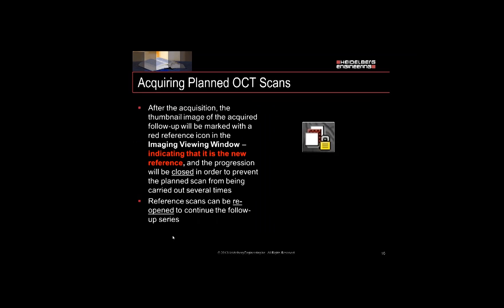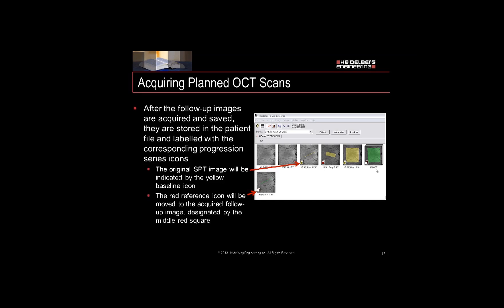After acquisition is completed, the follow-up will be marked with a red reference icon indicating that it is the new reference. This progression will be closed, indicated by the small lock icon. If you wish to continue the follow-up series, you can right mouse click and select Open. All scans are saved with original planned scans shown with the yellow baseline icon and completed scans with the green scan pattern and red reference icon.